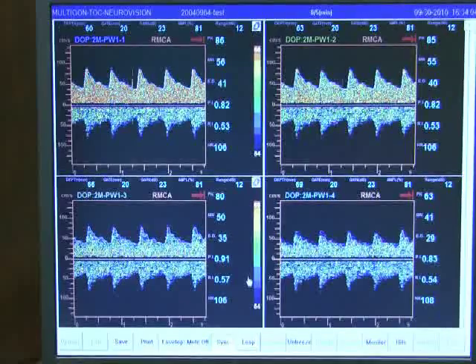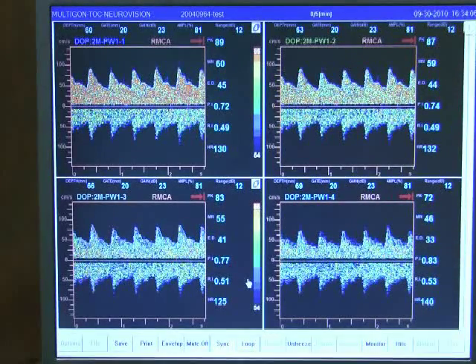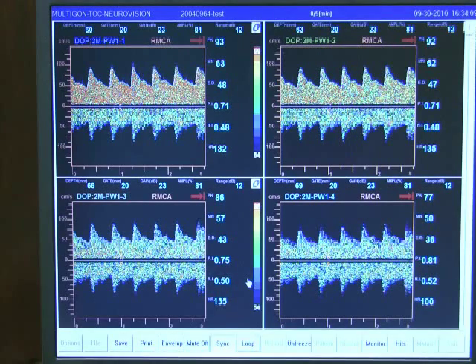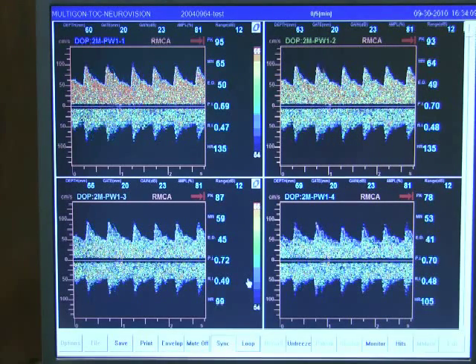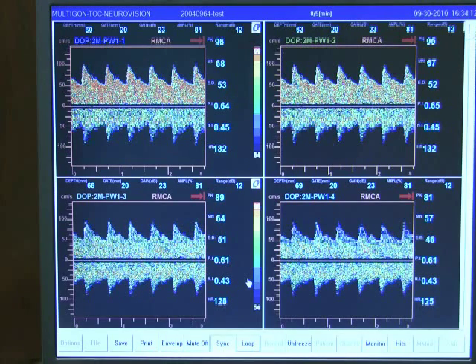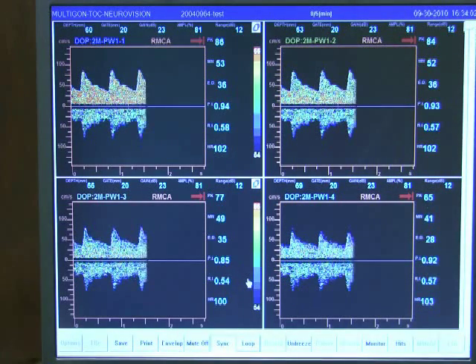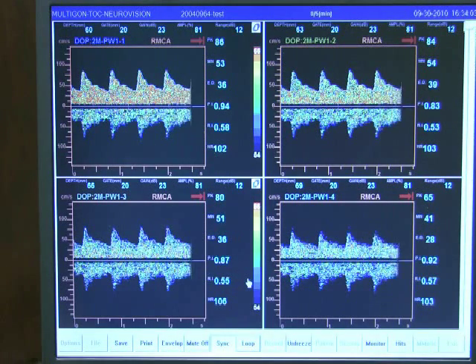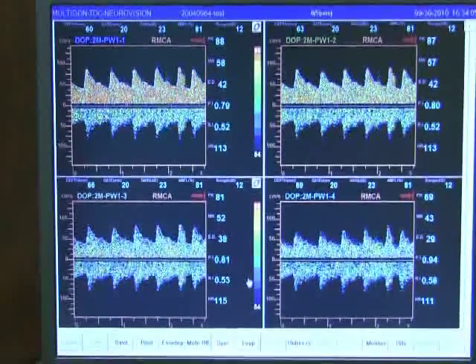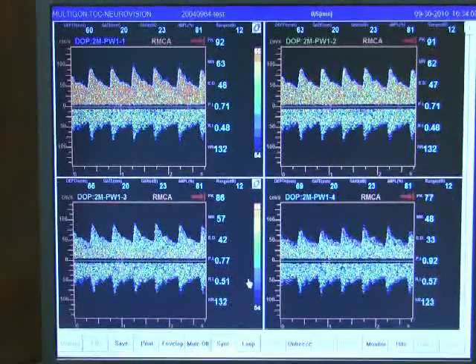By selecting display button on the bottom right, selecting 4-window display, you can see the same vessel at 4 different depths simultaneously. The top left spectrum is at a depth of 60, to the right is 63, bottom left is 66, and bottom right is 69 millimeters. Once you can save and report this just as shown on the screen.